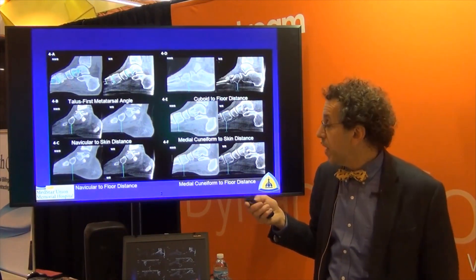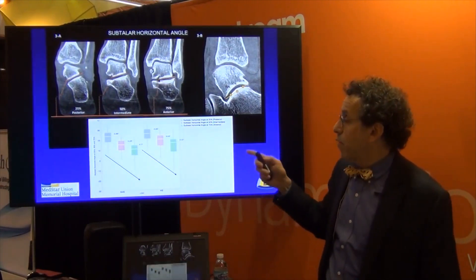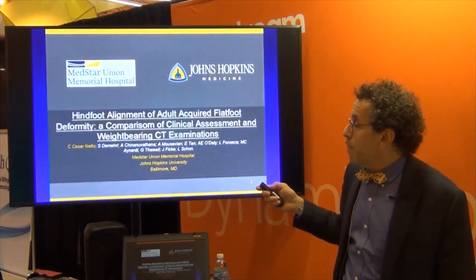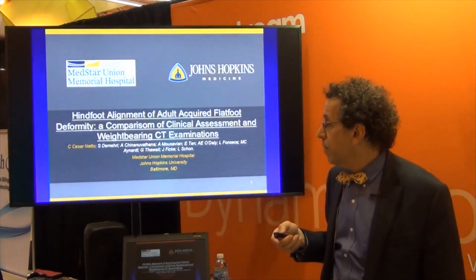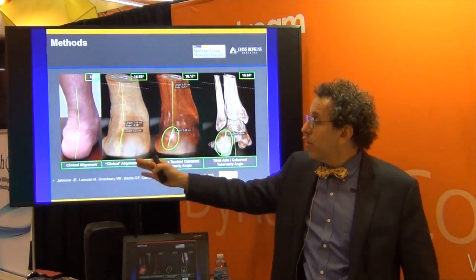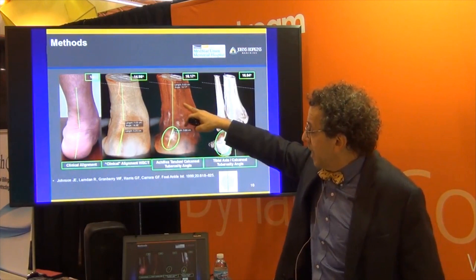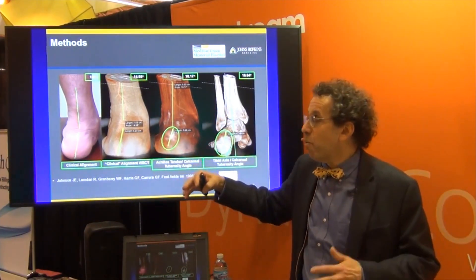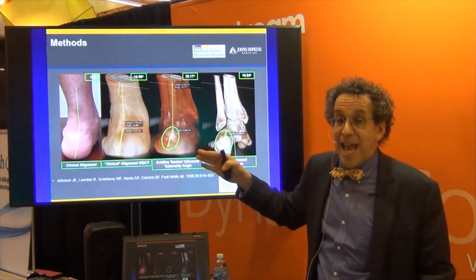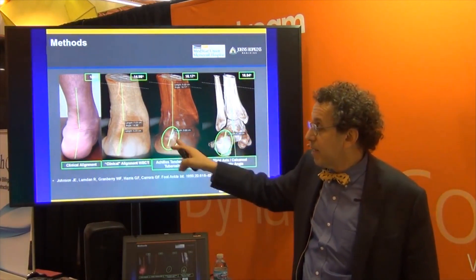We can also look at the subtalar horizontal angle to determine exactly where the deformity is occurring and where it can be reproducibly measured. We also looked at a comparison between clinical alignment and what we see on the CT scan. Here you see the clinical alignment on a weight-bearing CT, then we peel away the tissues to look at the Achilles to calcaneal tuberosity line — perhaps a better objective assessment of the angle. Even more objectively, we look purely at bony alignment to determine what the axis of the foot is and how much valgus is present.